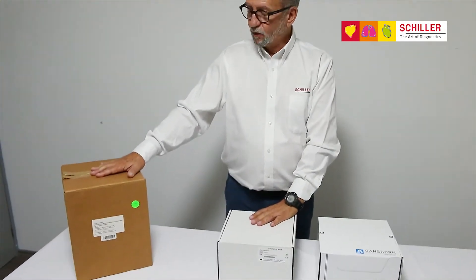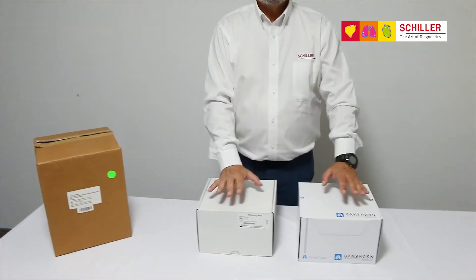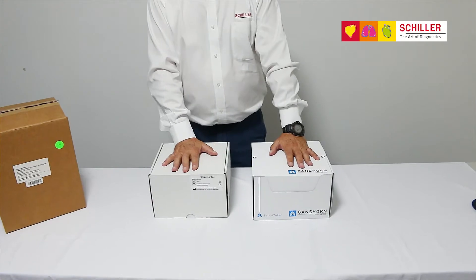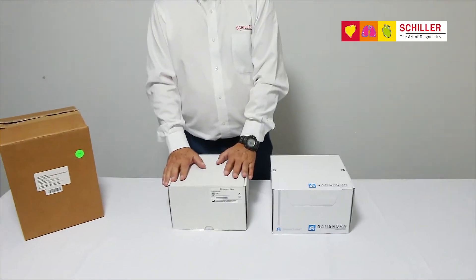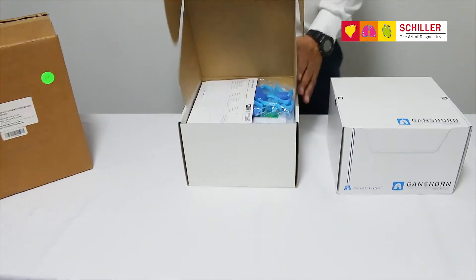The Spiroscout will come in one single box clearly marked with it, and inside there you will find two boxes. The first box, which would be on top, is the box that contains the actual Spiroscout.